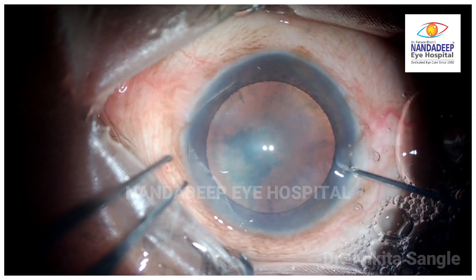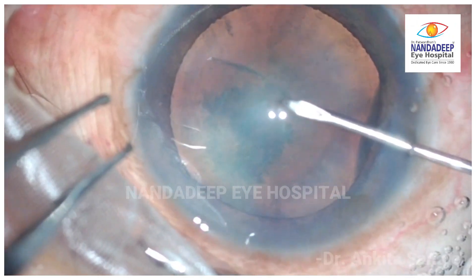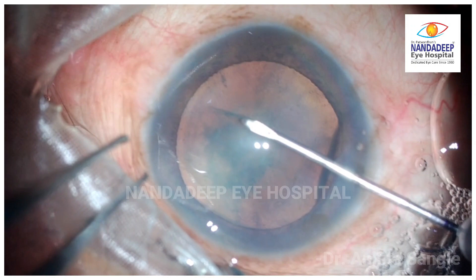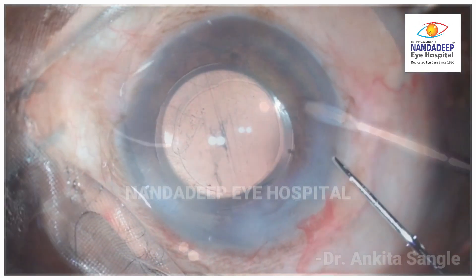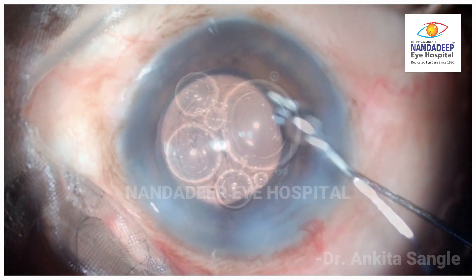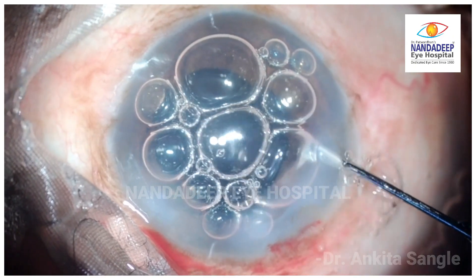Let's look at this please. Here, the surgeon trying to get in the cystitome for capsulorhexis accidentally touches the cornea and detaches the Desmet Membrane. The cataract surgery is carried out in a well-controlled manner avoiding the area of detachment, ultimately securing it with a tight air bubble.